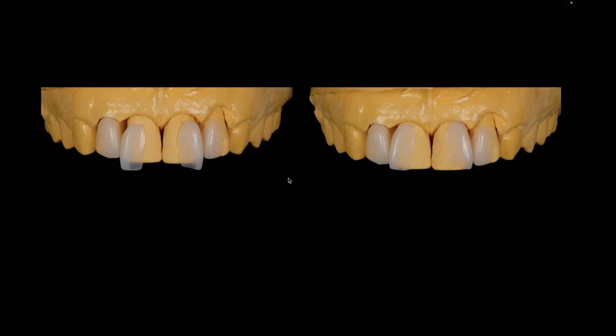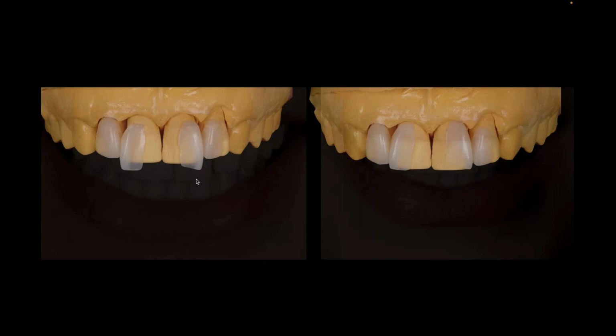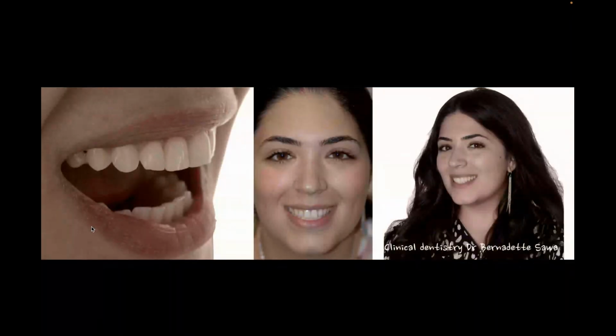So I did it on refractory dies. I devested these little window veneers, or these little window chips. Then you can see as I slide them into the patient's mouth how we're kind of changing the shape and the form of that tooth, so it looks a little more wide for her face and fits her face better. And in the end, that's all we wound up doing was 4 little chips on her. And you can see the difference in the face, right? 26 years old. She was here at the time.